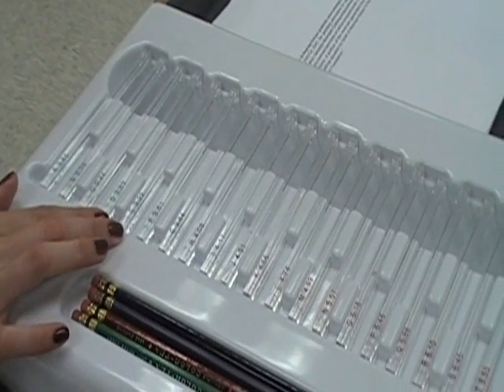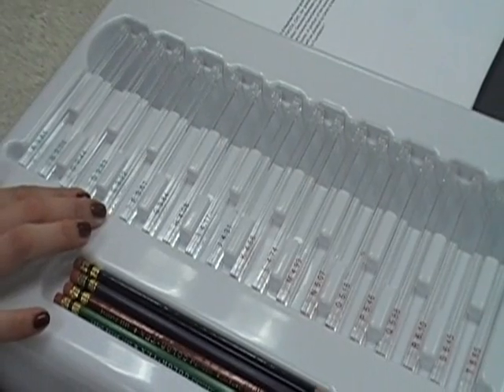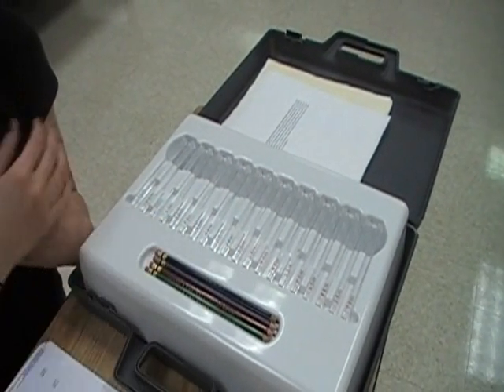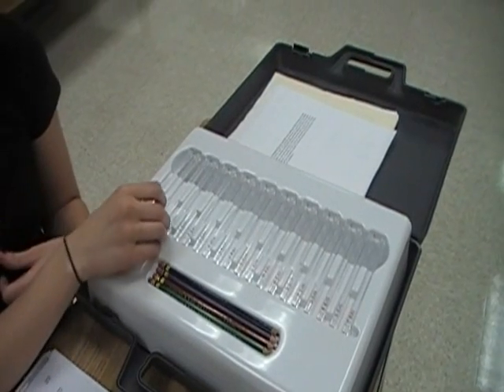For the blue and green categories, you would do three trials of each until they can feel it. For the higher ones, you would just do one trial and see if they could feel it or not.